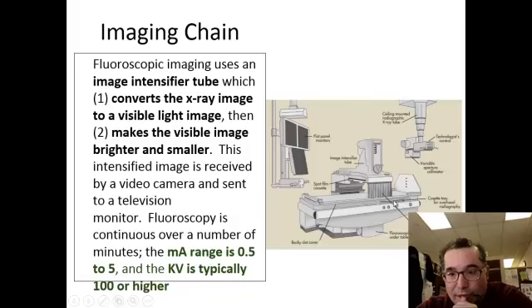Okay, we have to take our cassette tray, or could be a flat panel detector or a bucky, and we have to move it temporarily out of the way. So our patient would be situated on this table and using something known as ABC, or automatic brightness control, which is a computer program that will allow the physician to basically move this fluoroscopic carriage from areas of thick parts to thinner parts or vice versa, and not have to automatically go outside and change the technique to adjust for a thicker or thinner part.